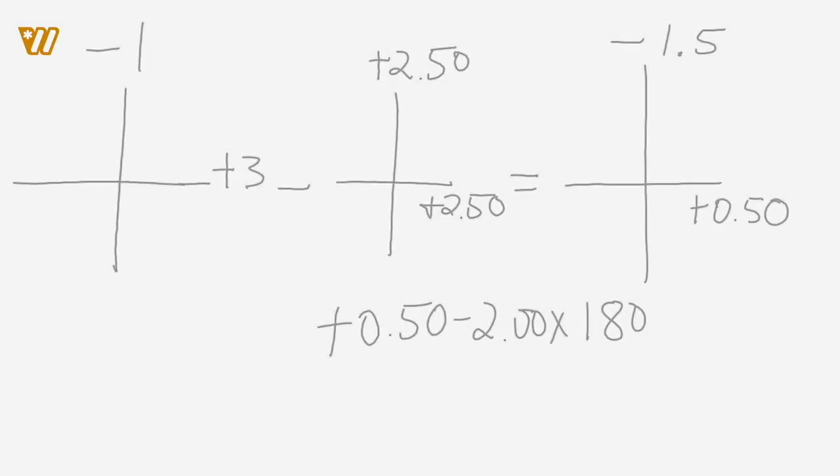Whenever I'm doing a retinoscopy example with astigmatism, I always draw down power crosses, because in my personal experience I've made little mistakes too many times that have cost me points whenever I was in school. Even whenever I'm doing free retinoscopy with ret bars and the patient has astigmatism, I just draw down a power cross on a piece of paper, because it's easier than trying to make a mental note of where everything's at. So if you guys can do this mentally, great. But for me, I need the power crosses.